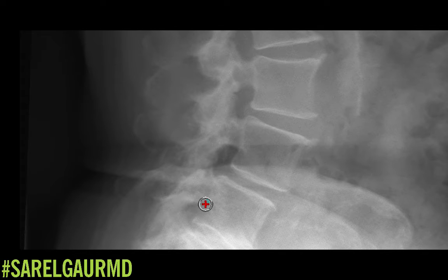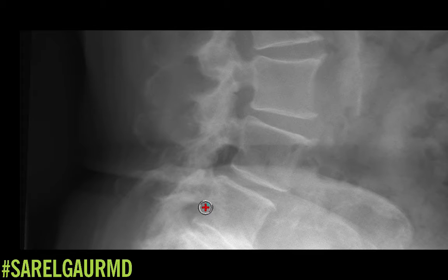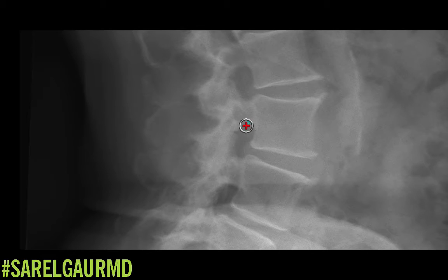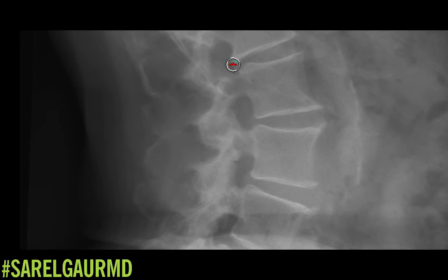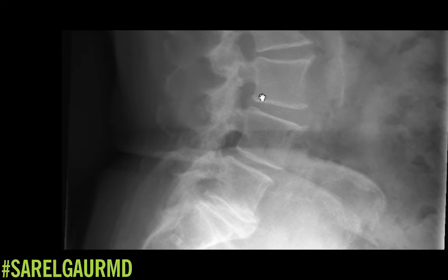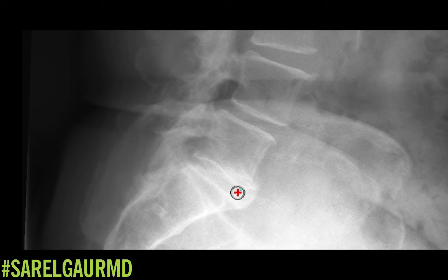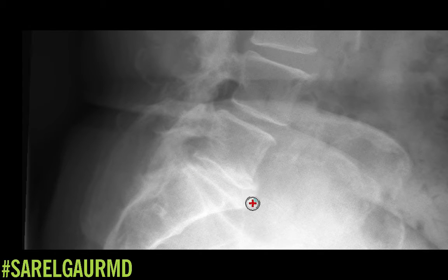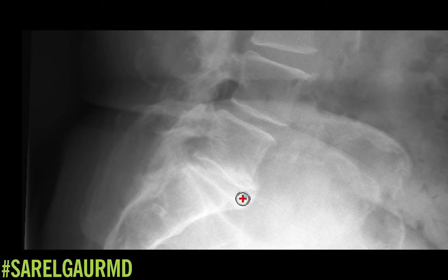Looking at the neural canals, this one might be slightly stenosed from some facet disease and a little bit of lipping at the posterior aspect of the vertebral body. The other neural canals look okay. Now looking at the disc levels: at L5-S1, there's probably at least moderate loss of disc height. There is a disc osteophyte complex anteriorly, so this disc is somewhat fused — there could be a lot of loss of motion at this motion segment.